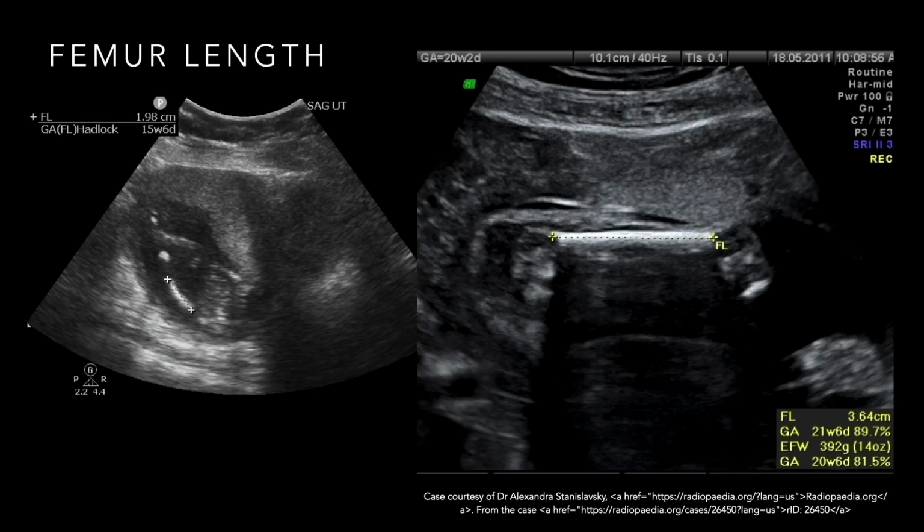being careful that you've oriented your probe in such a manner that you actually have found the entire full length of it and not foreshortening it. And this is really the major pitfall, is you can foreshorten that femur and not realize it. So you want to very carefully manipulate that probe to make sure you're on the full length of the femur and measure it.